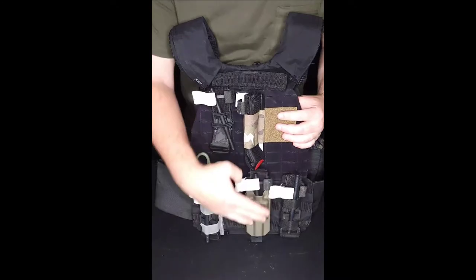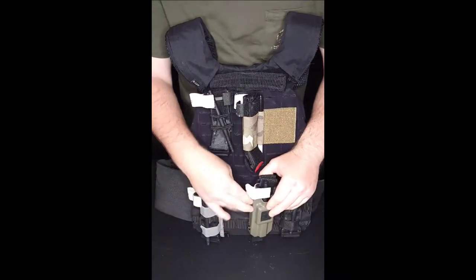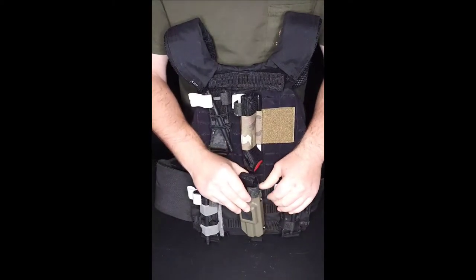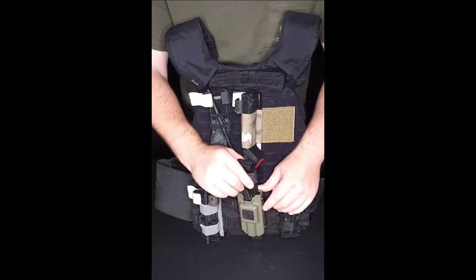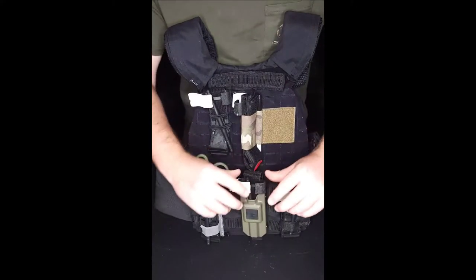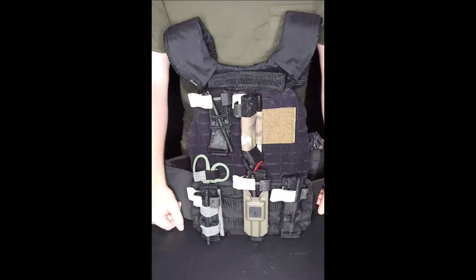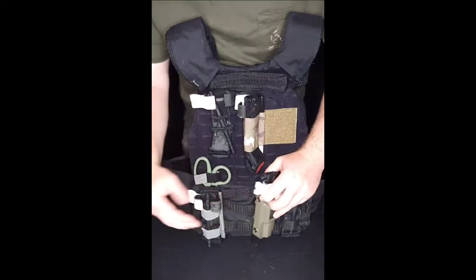Starting off, this one I bought off Amazon — it was $13. This is just a plain kydex one. They do sell different attachments for it, like a back piece, because when I was wearing it I had a lot of issues with it catching on a shirt and pulling out if you move, and the back piece prevents that. I actually have two of these; I keep one in my car — it keeps nice and folded, and you can slip it on a belt if you want.